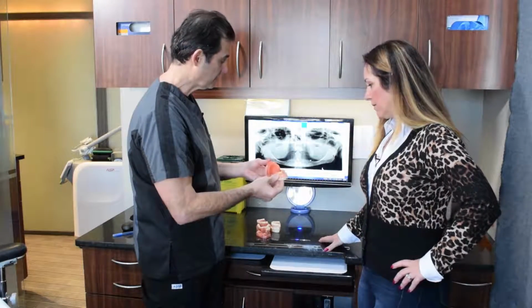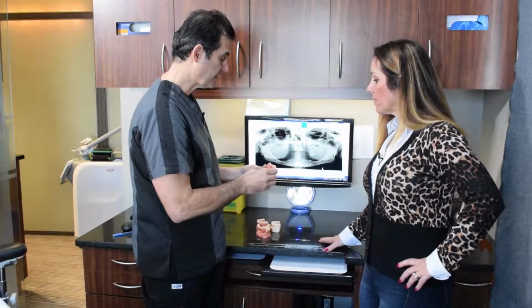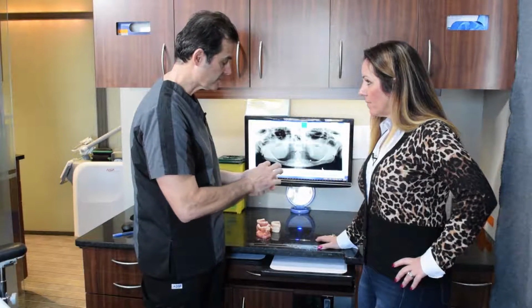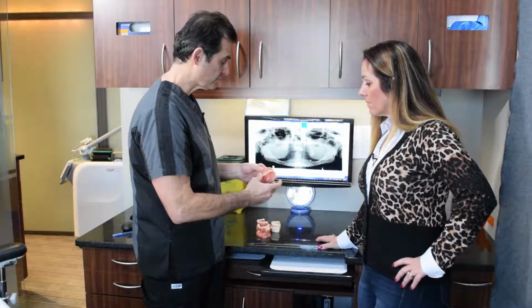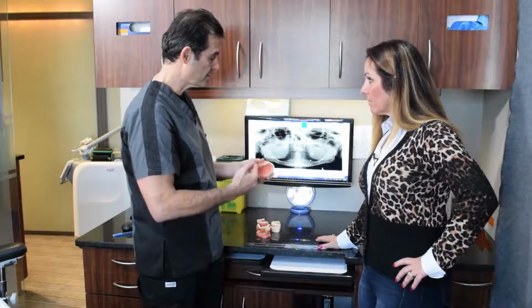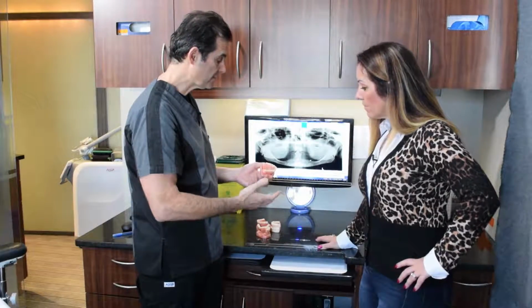Right, and we don't want that. We call that being a dental cripple. Typically they can't wear their dentures at all. At this early stage where they still have a good jawbone, the denture fits them pretty good. After 20 years or 30 years of wearing a denture, they're falling out, they're not able to function anymore at all. So what we did was we have invented ways of making this denture stay in better.